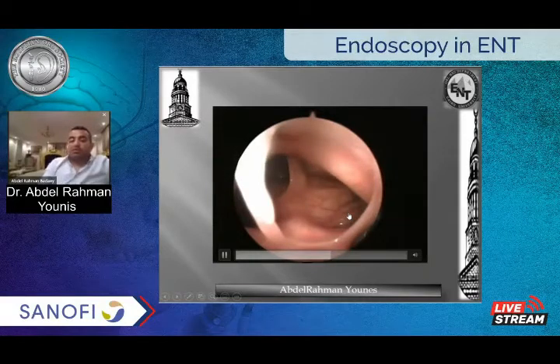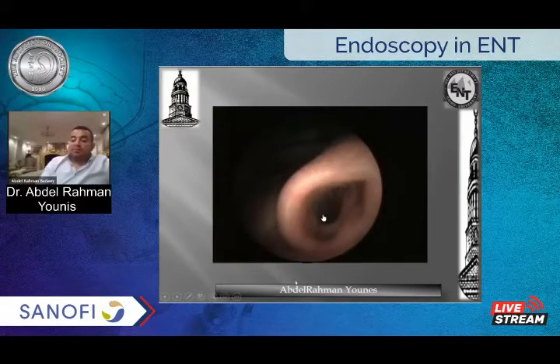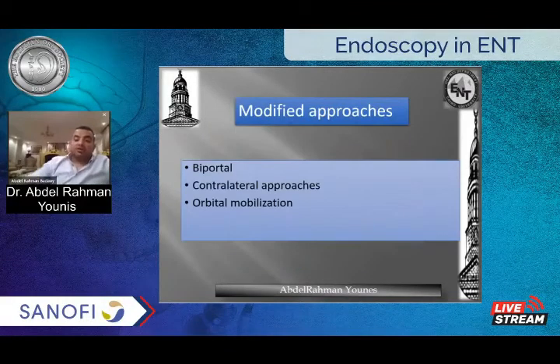So this is a Draf type 3, and we have another modification of this Draf type 3 if we need to reach far lateral in our frontal sinus.